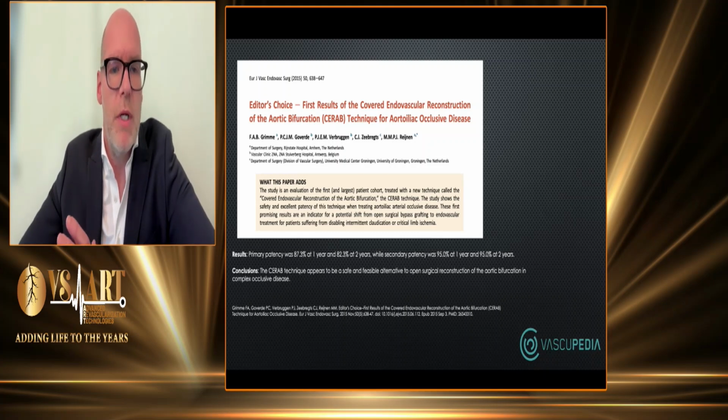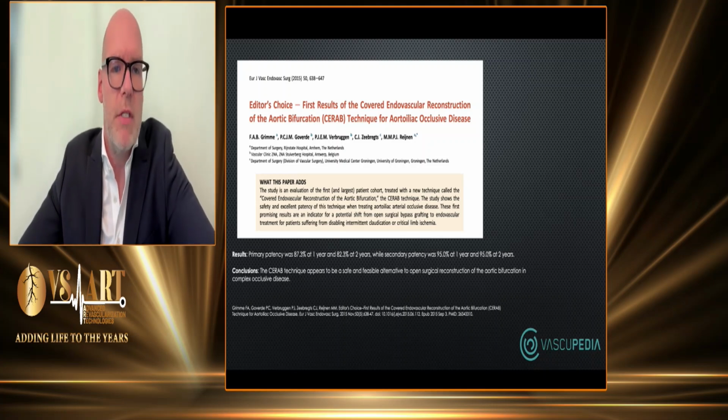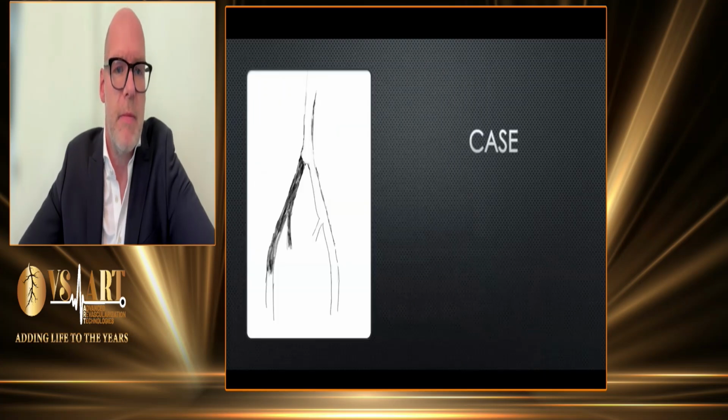That is the conclusion: the CERAB technique is very feasible and an alternative to open surgical reconstruction in aortic bifurcation or complex occlusive disease.